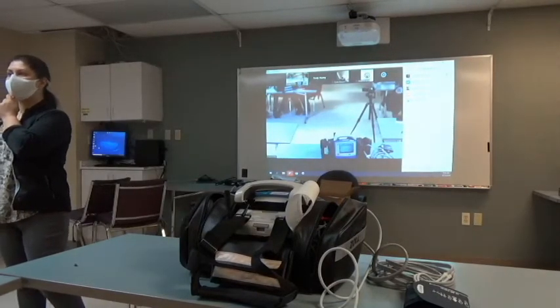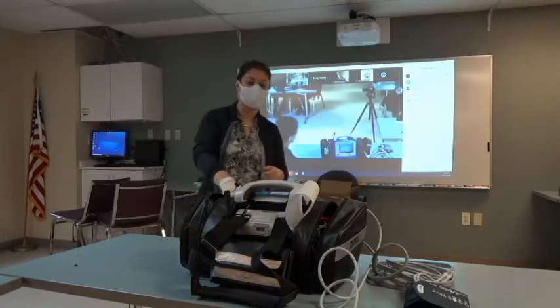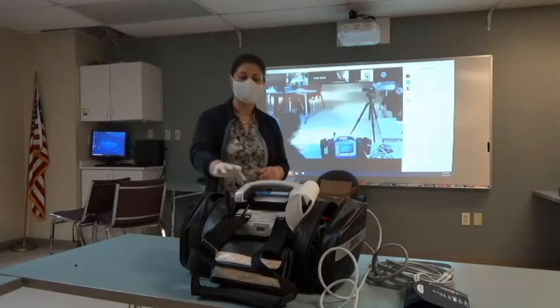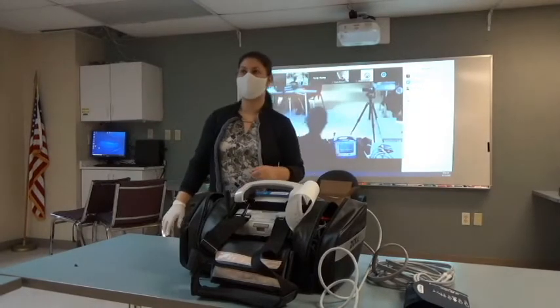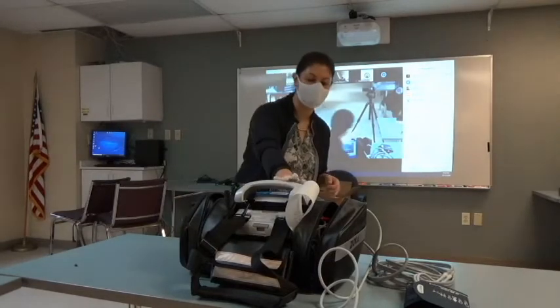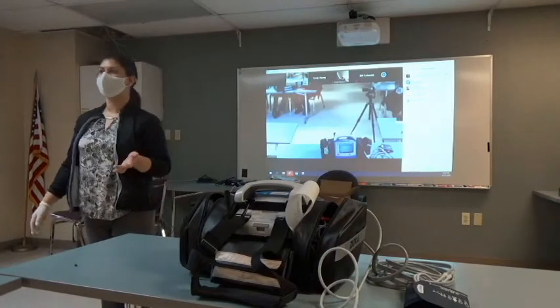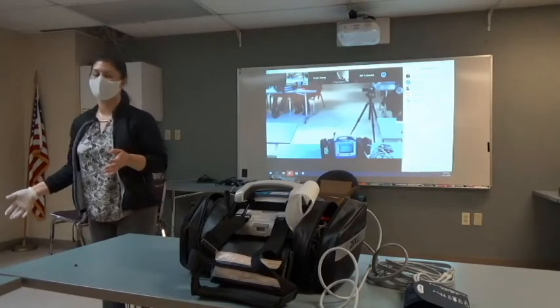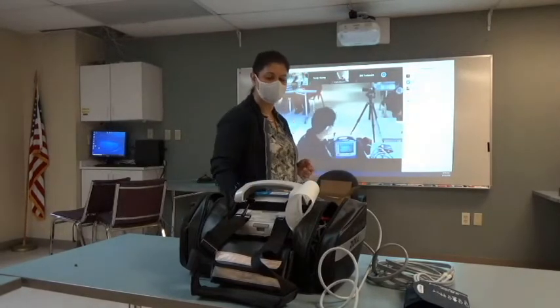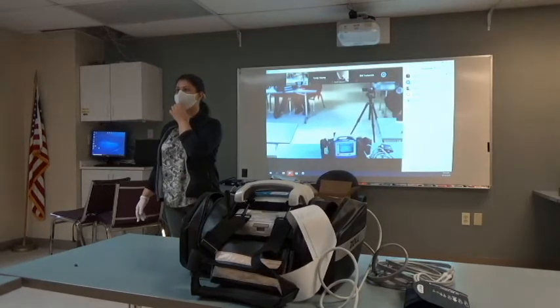So if you ever needed a hard copy of that, that's where we would access it. And you would just hit print? You would hit the roll of paper when you hit the enter key, yep. Go ahead and press the home button to get rid of that menu. We're now gonna go to print trends, which is another way that we can access that vital signs trending window. This one we are going to print because it's not going to be as long as the treatment summary. So you're going to hit the enter key, find the roll of paper, press the roll of paper, and that will print out a trend of vital signs.